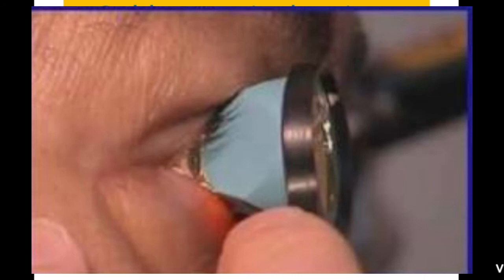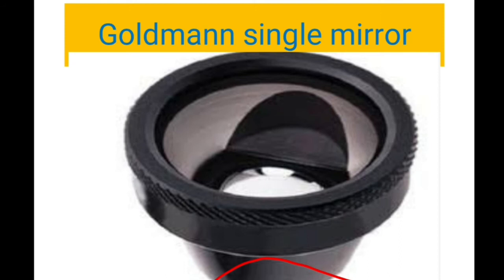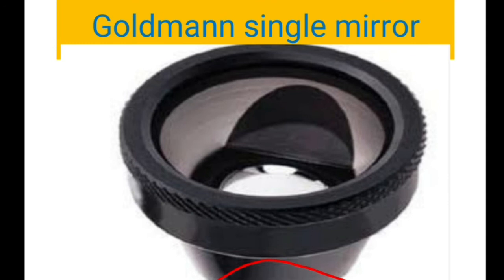Make sure that air doesn't come in between. Now you will be able to visualize the angle. Remember, you are seeing the opposite part of the trabecular meshwork. Suppose the mirror is at the superior quadrant, means you are visualizing the inferior half of the anterior chamber. After analyzing the angle structures, rotate the goniolens to visualize the next part of the trabecular meshwork.